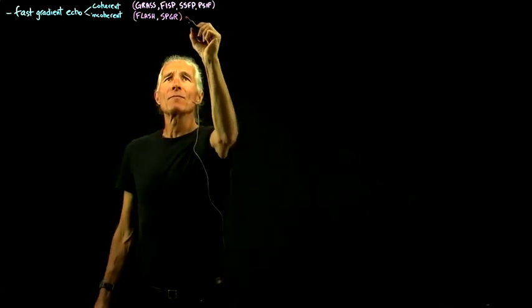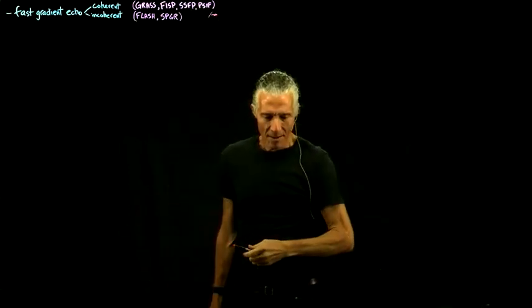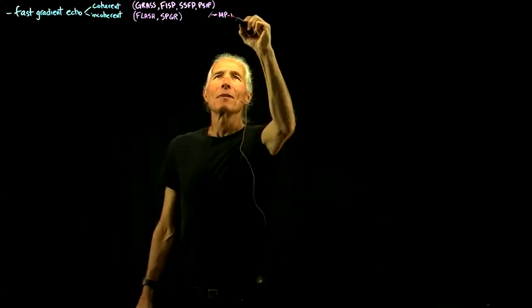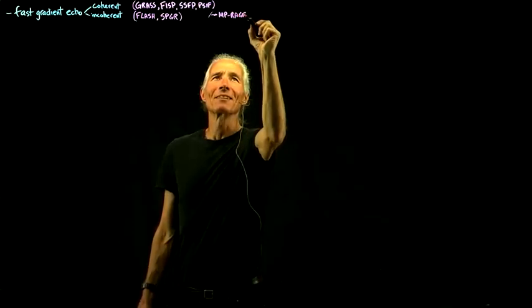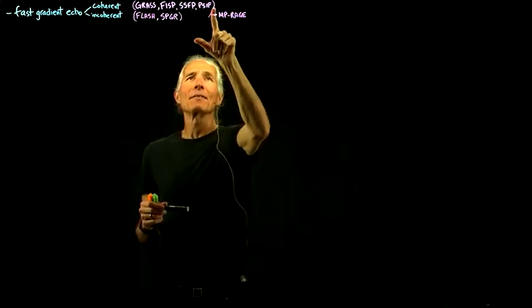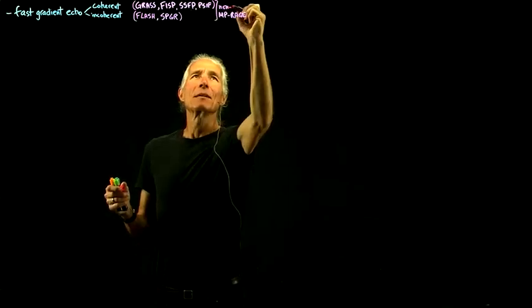But then there's a version of this one, kind of like a combination of both of these two, called MPRAGE, and we'll talk about that. That one's magnetization prepared rapidly acquired gradient echo. I looked up what it meant. I never knew what it meant. I learned the word without knowing what it meant. That one's kind of a different one. This one's a non-steady state, but it's extremely common.